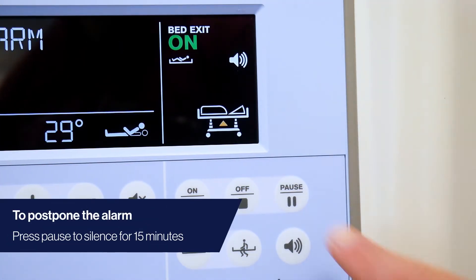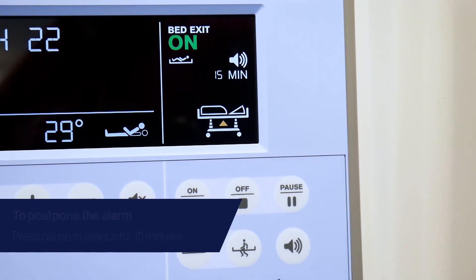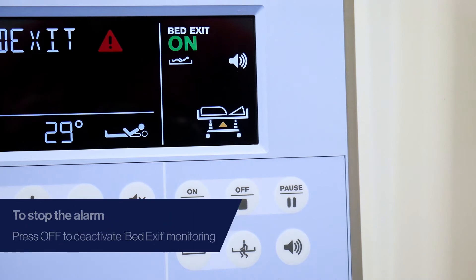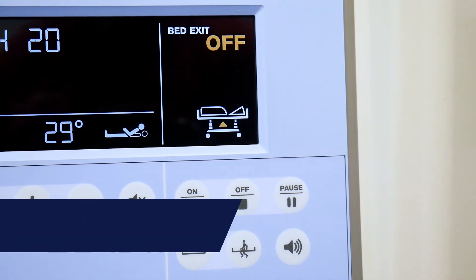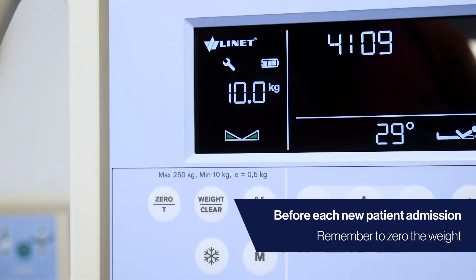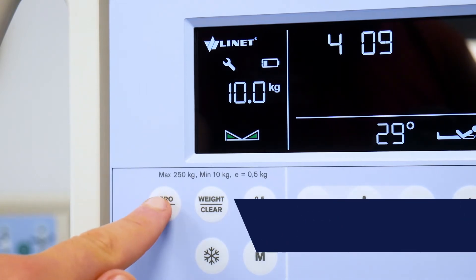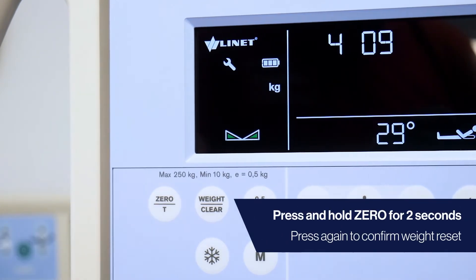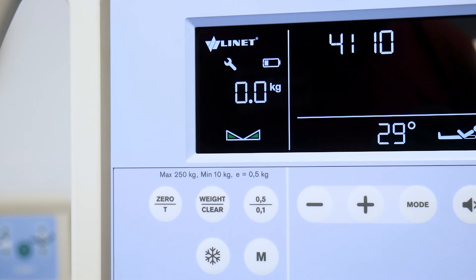If the alarm is triggered, press the pause button to postpone the alarm for 15 minutes. Alternatively, press the off button to deactivate the bed exit monitoring function. Before each new patient admission, remember to zero the weight. Ensure that nothing else is touching the bed. Press and hold the zero button for 2 seconds to zero the weight, then press again to confirm the reset.